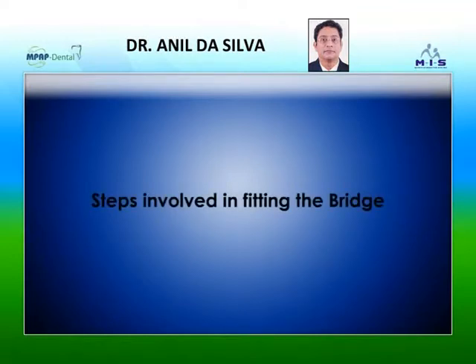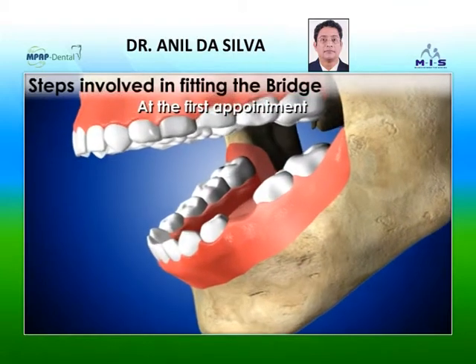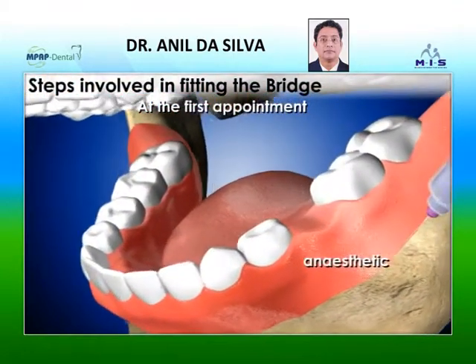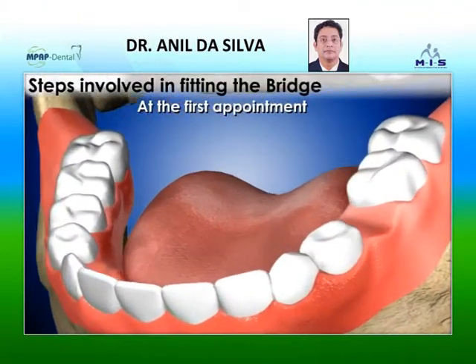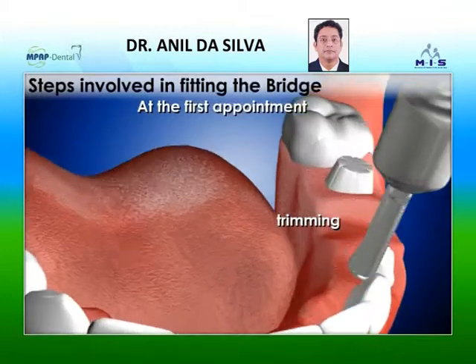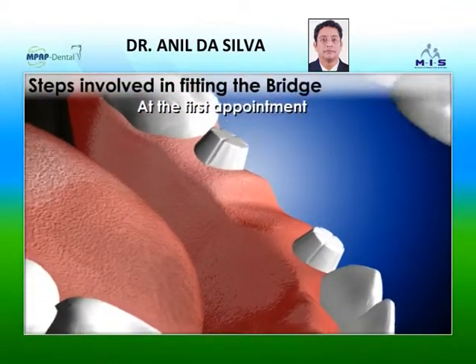Steps involved in fitting the bridge: At the first appointment, the dentist will numb the area with a mild anesthetic. The teeth on either side of the space are prepared by trimming away a small area in order to accommodate the new crown over them.